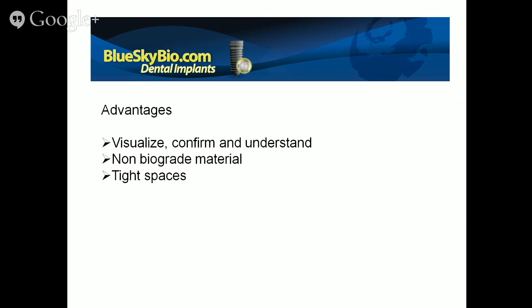Before we do that, let's discuss for a minute the advantages of the model-based technique. There are really two techniques for guide fabrication that you could use with Blue Sky Plan. One is the model-based technique, which we're going to be discussing. The second is digitally designing the surgical guide. Now, the obvious question is, why do you need two different techniques?